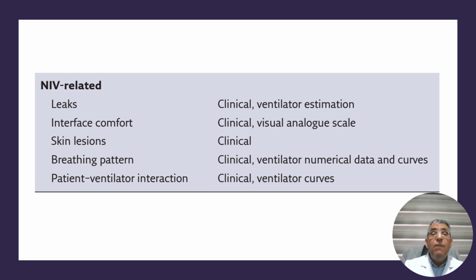What about the patient comfort? Is the patient comfortable with the interface or not? Is the patient fighting the interface? Does the patient have skin lesions or not? This will contraindicate the use of an oronasal mask, and we may use a full face mask, or we may use a helmet if there are lesions in the skin.